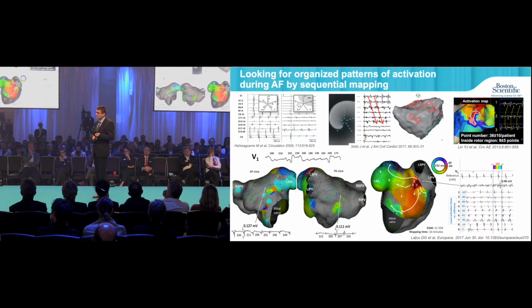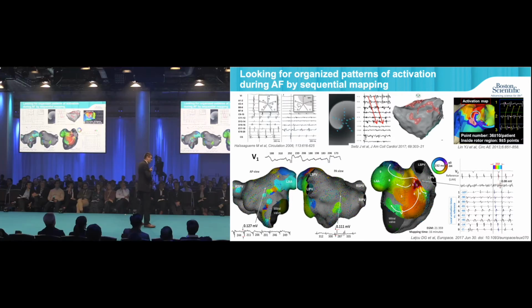That is not interesting. Nevertheless, on the lateral aspect of this left atrium, there was a focal propagation pattern coming from a site which showed very pathological continuous fragmentation. And ablation on that site terminated AF in this particular patient.